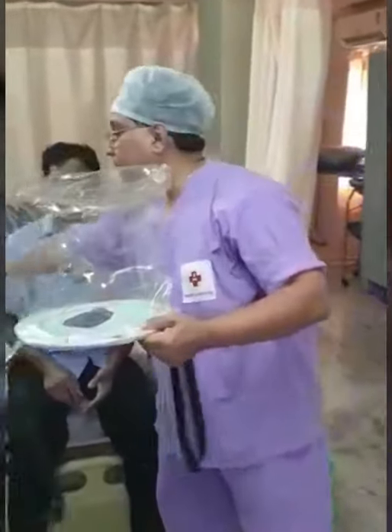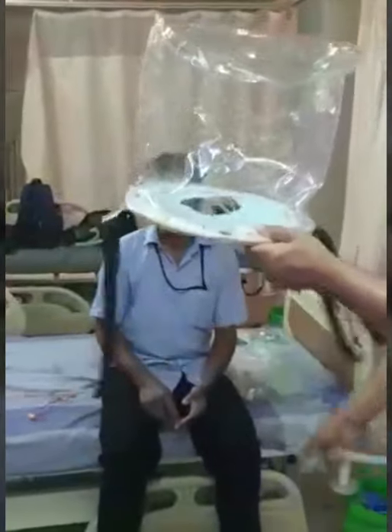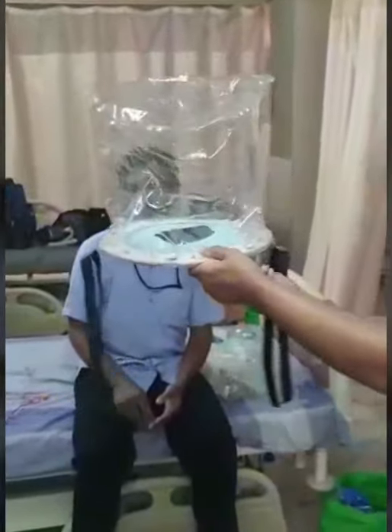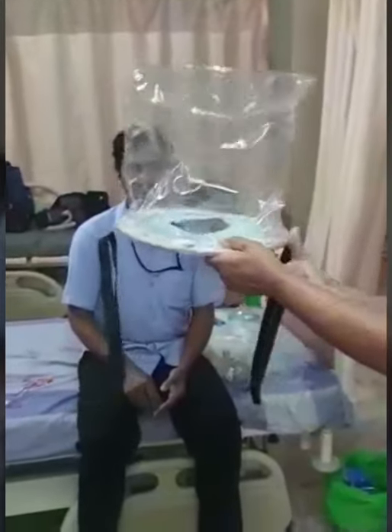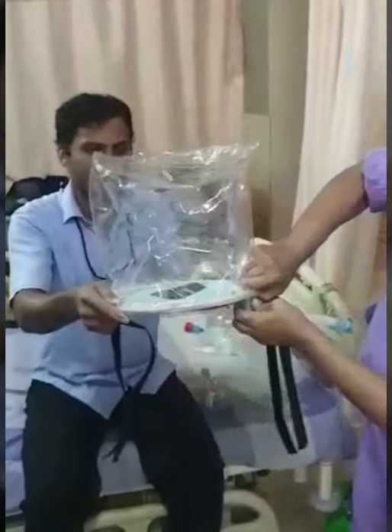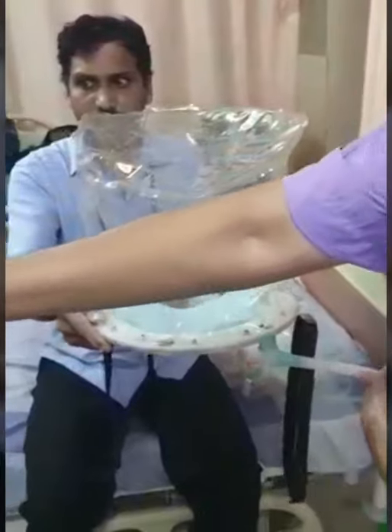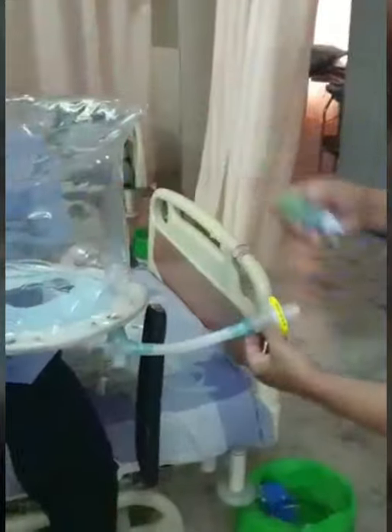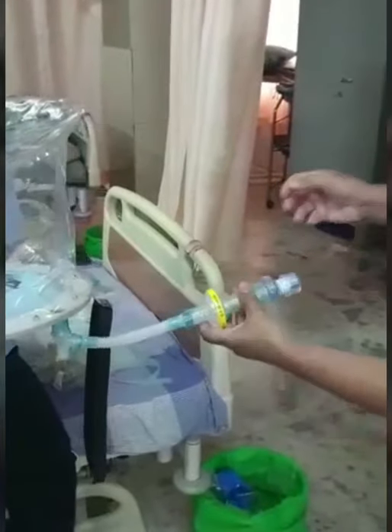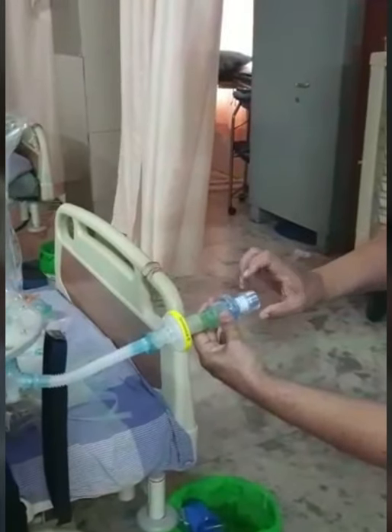Once the hood is opened, we fix one catheter mount to one of the ports. And then we fix a viral filter to the other end. And then we use a mechanical PEEP valve and fix it. This mechanical PEEP valve has settings to give PEEP from 5 cm up to 20 cm.